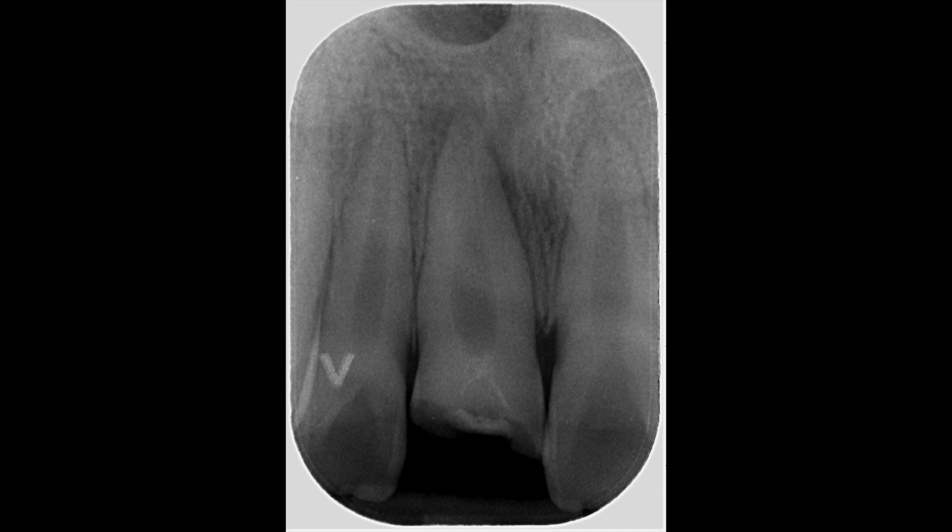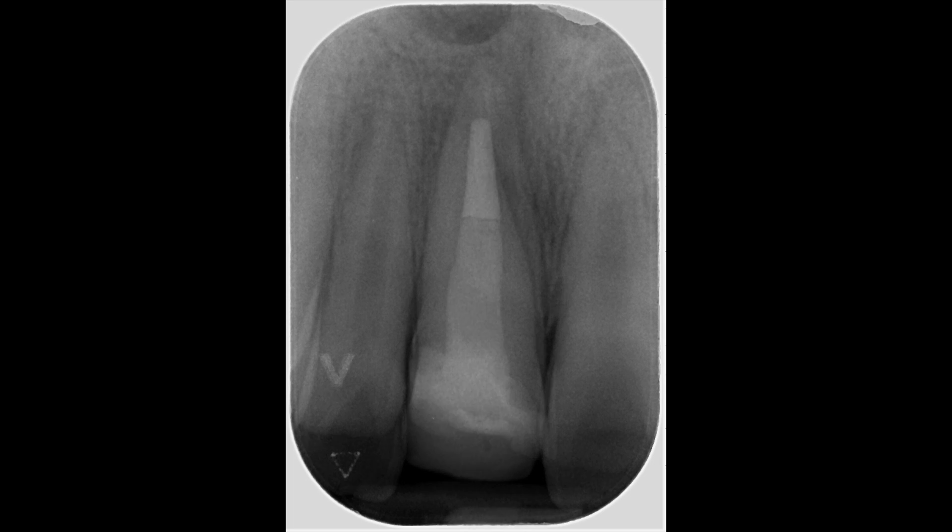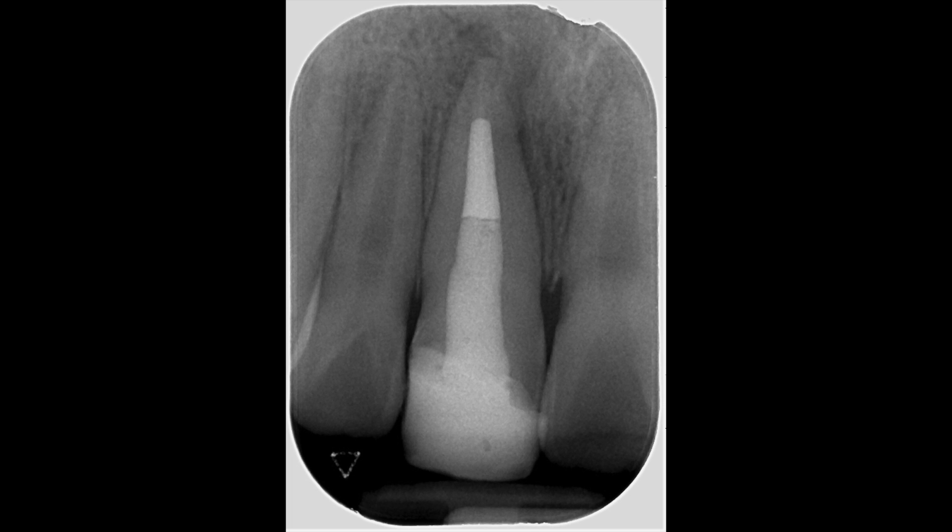Here you can see the preoperative radiograph of the traumatised tooth showing the periapical abscess. The final radiograph shows an excellent apical coronal seal with all the various materials: biodentine, gutta percha, dual-cure composite and light-cured composite.